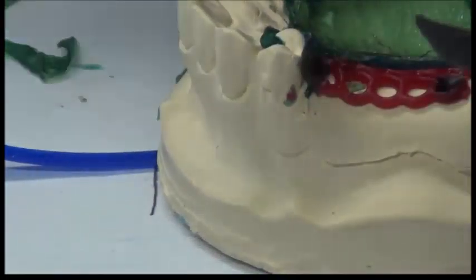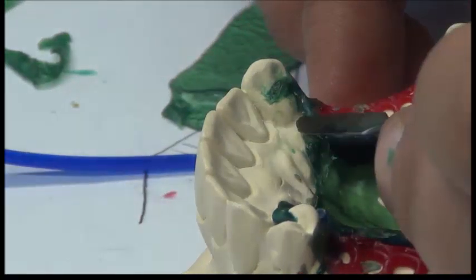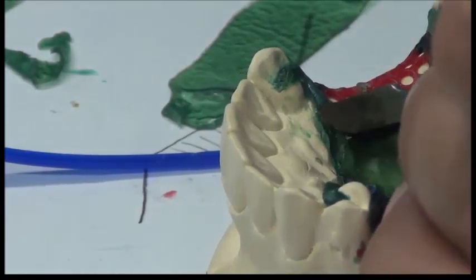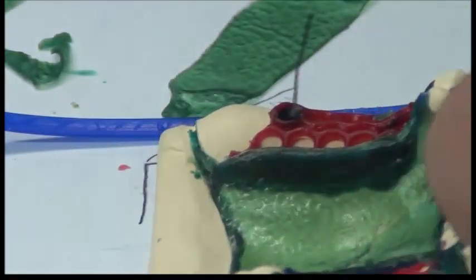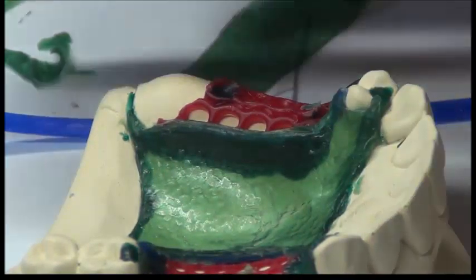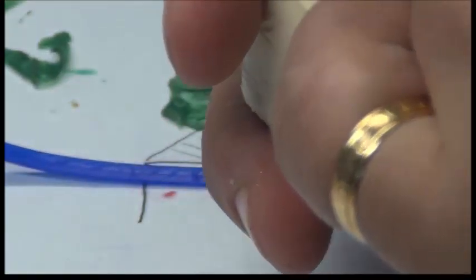Now on this side I have two options as well. So once more, I have the option to cover the canine with the major connector, and this will form a plate, or I can expose it, making sure that the rest is well connected to the guide plate, not to the major connector. Okay? On this side, I have the two options as well. I could join the minor connector with the guide plate with a plate on the tooth. Okay, this is option number one. I could free them. If I want them separate and I want to expose this marginal gingiva to be more hygienic, I can run down.